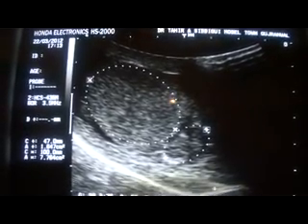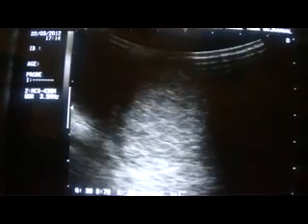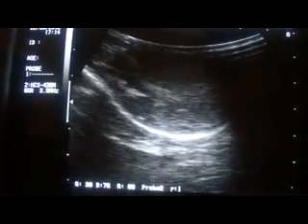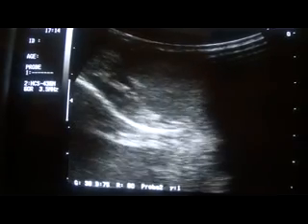Now we are taking another section. I am going to scan the right testis in longitudinal section. This is the reason why the patient is complaining of severe pain — in this region you can see that the scrotal wall is thick.